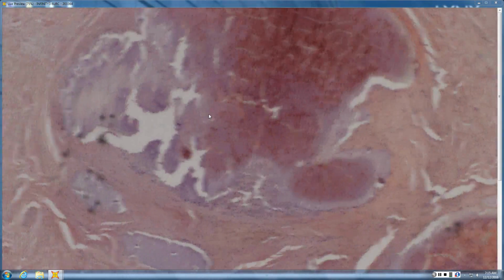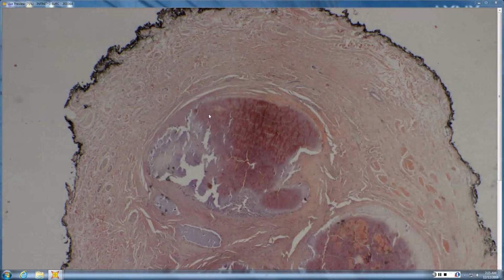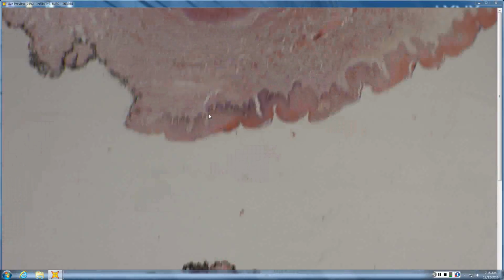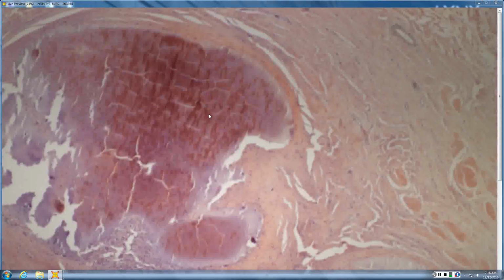MEN2A. Might be out of the book as well. Okay, for sure, scrotal calcinosis. So how do you know it's scrotal calcinosis, other than this is the slide from the book? You've got rugated epithelium. Because they're not going to do that to you on your test, promise. Oh, that smooth muscle high up.